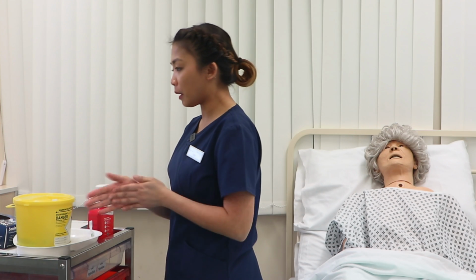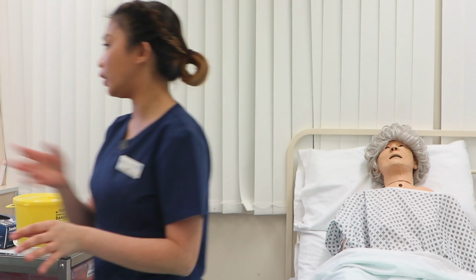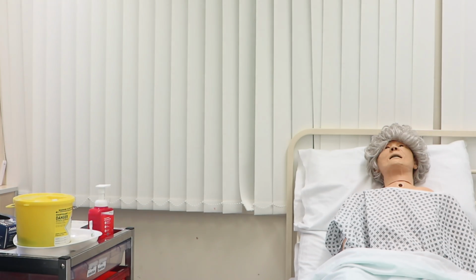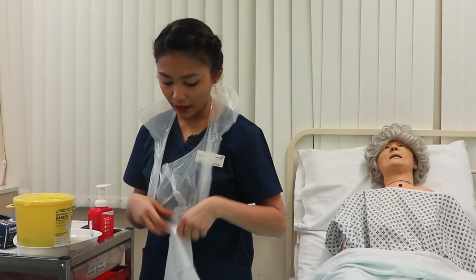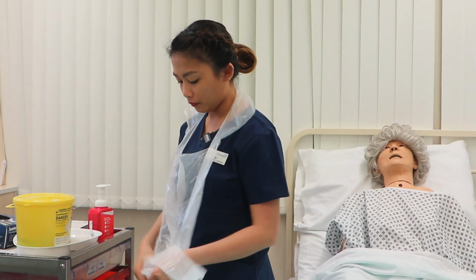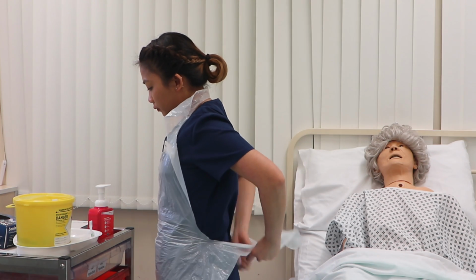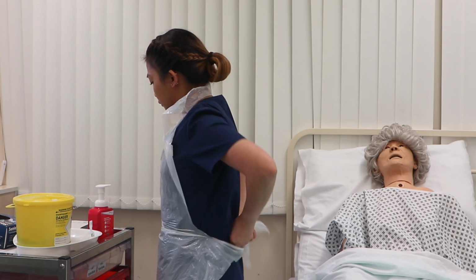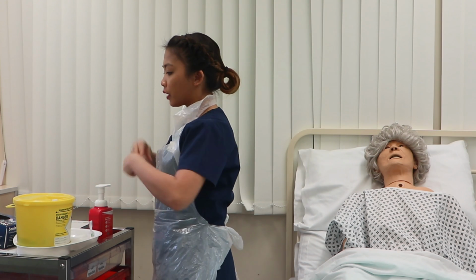Now I'm gonna prepare my medication. I'm gonna wear my apron, making sure that the clean part is facing my patient. Hand rub. Wear my gloves.